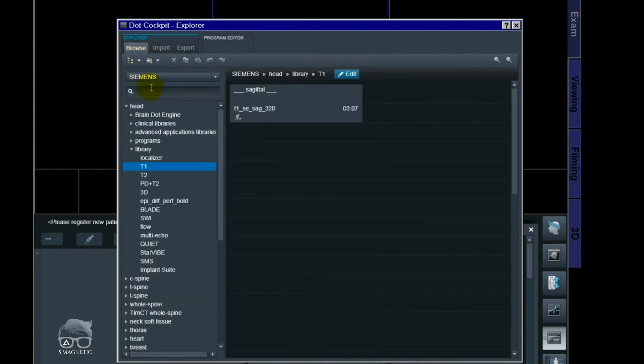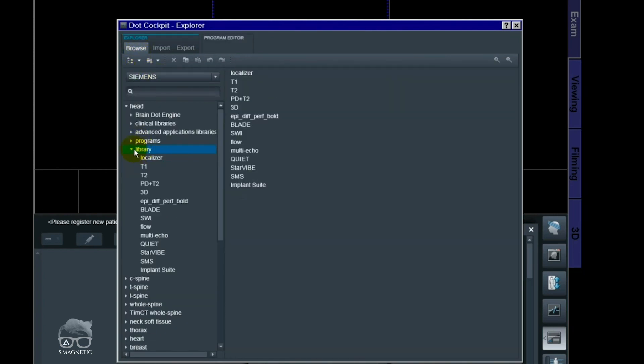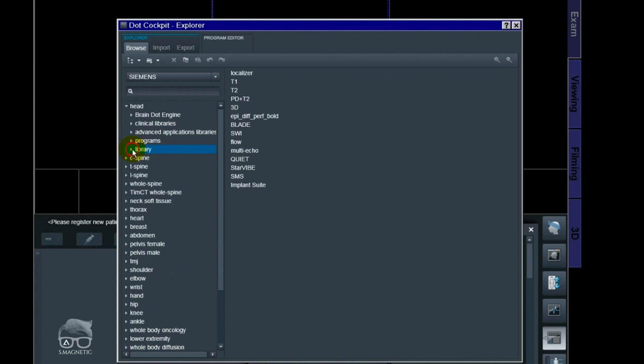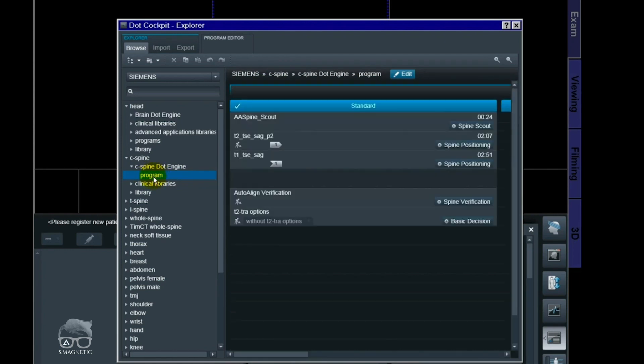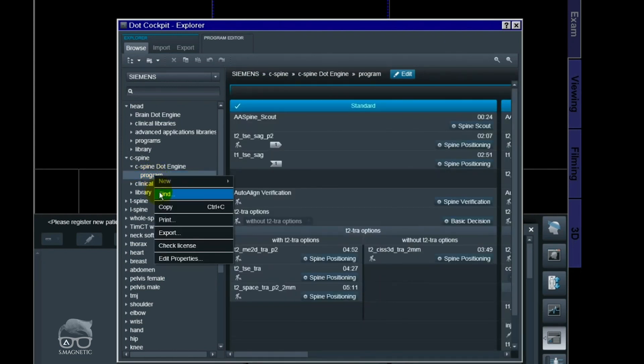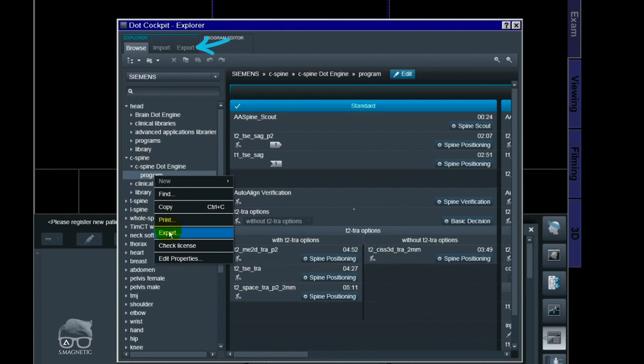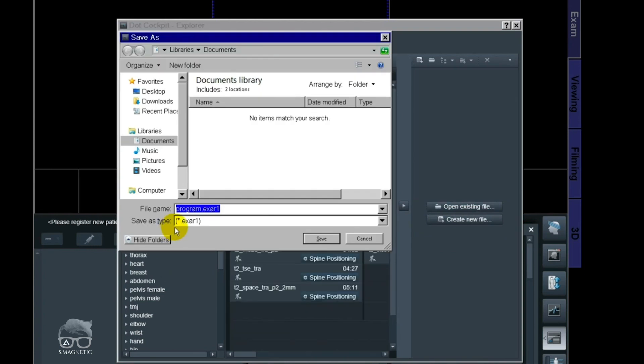Besides that, let's go for the export. I'm just going to export the program right here. So either you can right click and you can find the export button right there, or up in the corner right there. It's the same. So if you have a USB pen inside, now you can just choose that one and choose the name and click save.